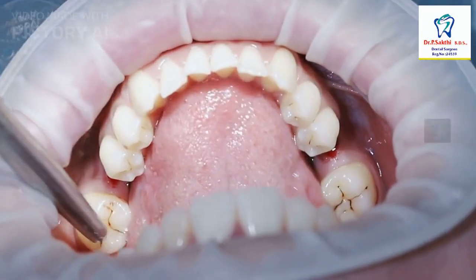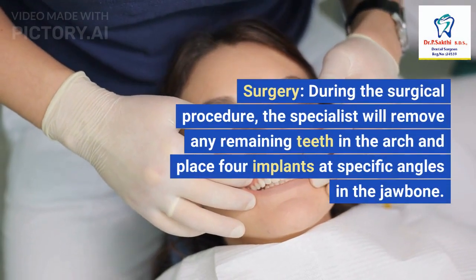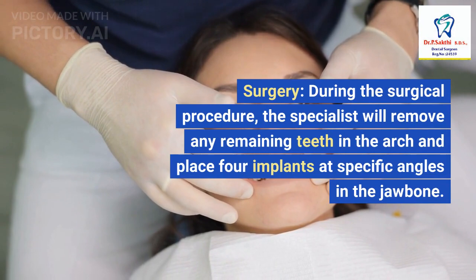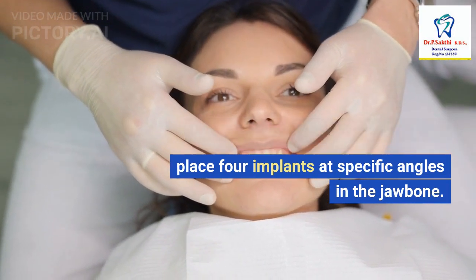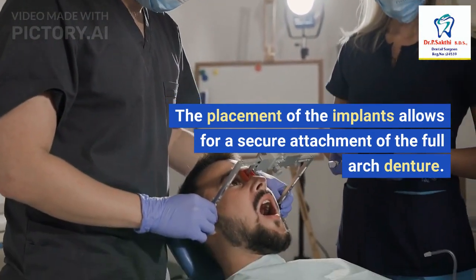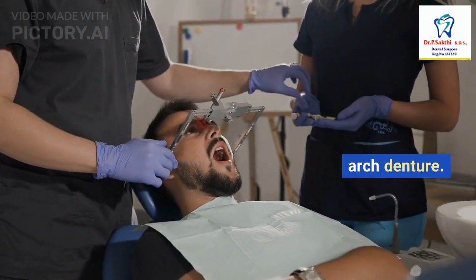2. Surgery: During the surgical procedure, the specialist will remove any remaining teeth in the arch and place four implants at specific angles in the jawbone. The placement of the implants allows for a secure attachment of the full arch denture.